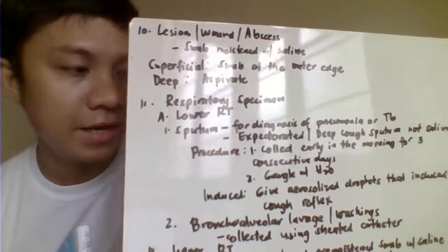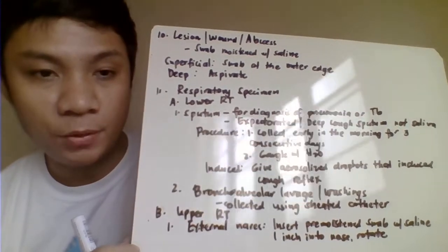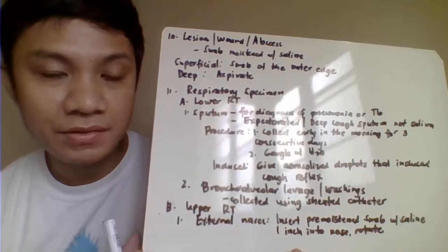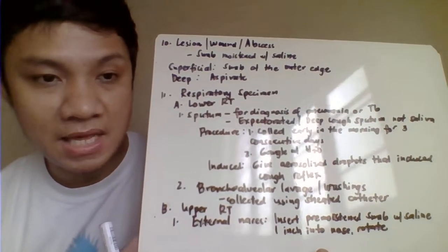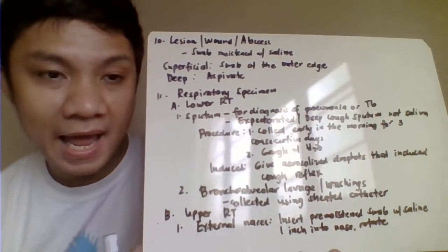Okay, then we have here the collection of specimen, with your lesion, with your wound, or we have your abscess. So when collecting the specimen, first you need to disinfect here the skin, with your swab pre-moistened with your sterile saline.